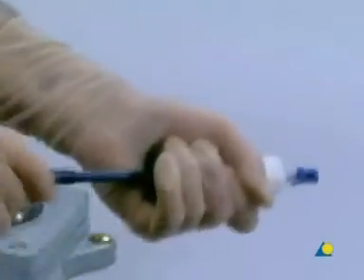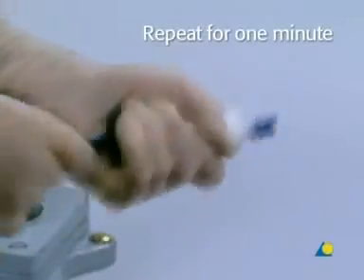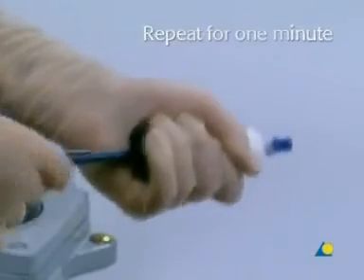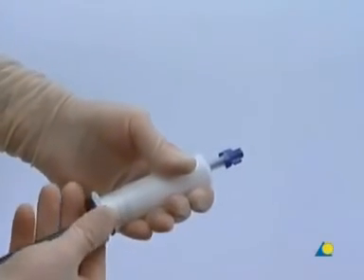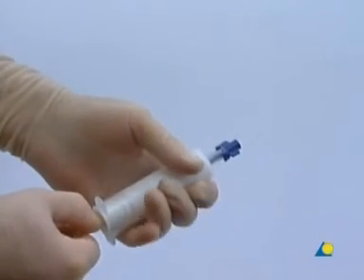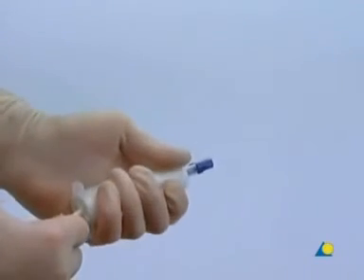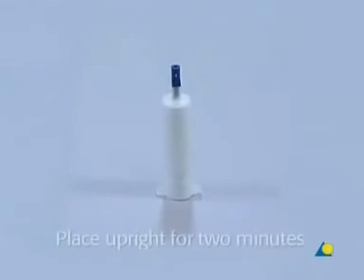The Chronos inject is mixed by moving the blue plunger back and forth from stop to stop for a full minute. The plunger is rotated at the same time. After mixing is complete, the plunger is fully pulled out and snapped off. The cartridge is placed upright for 2 minutes so that air bubbles can escape.